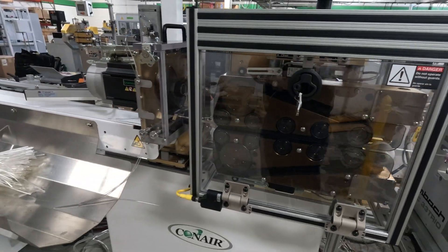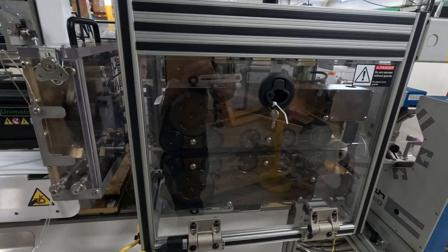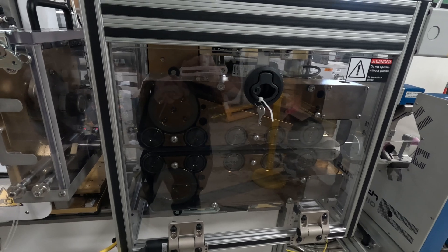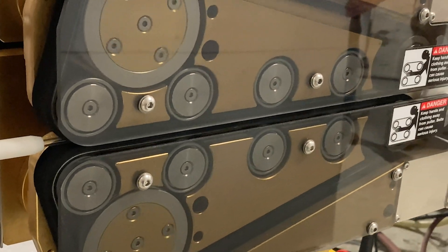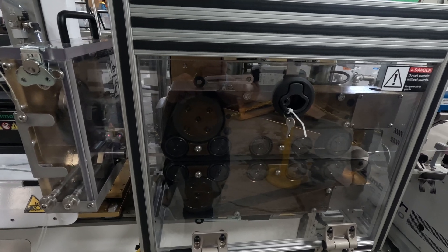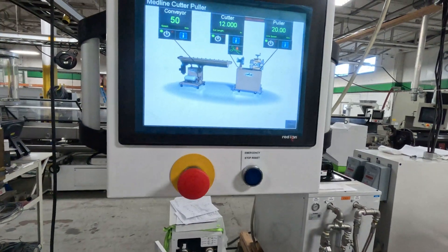Next stop in the process is Conair's Medline puller-cutter combo, and what's happening here is that the line speed is adjusted to create the taper in the tube. If you look closely — I'll put a clip in here — you'll see that these wheels move faster or slower: they increase speed to decrease the line size, and decrease speed to increase the line size, to make the taper in the tube. That's all controlled on the Medline cutter-puller screen.